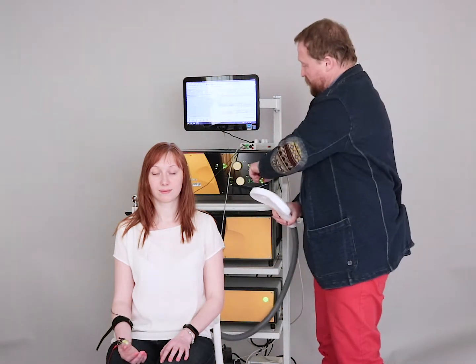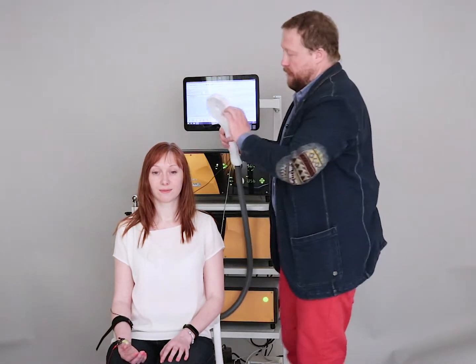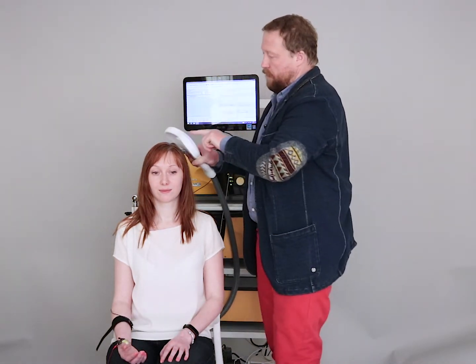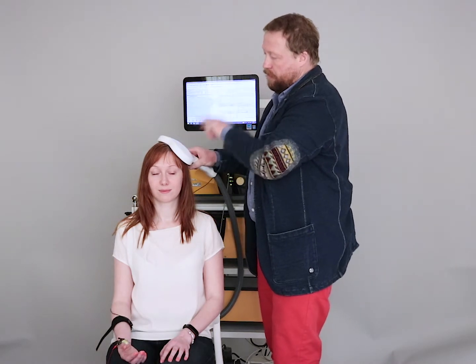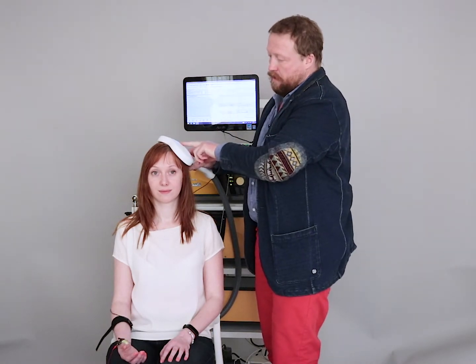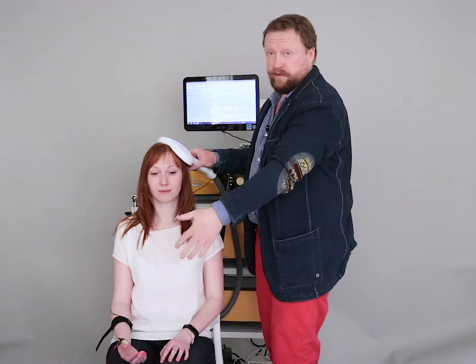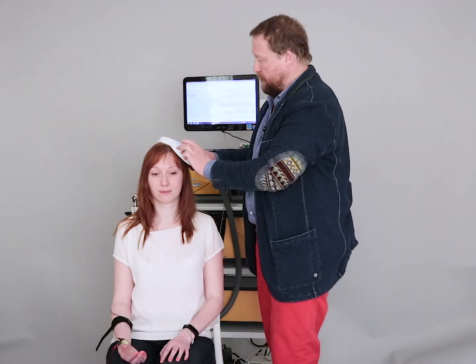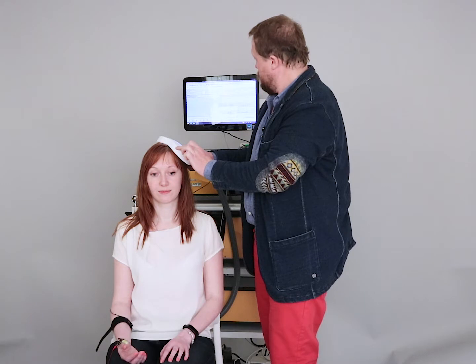I take the coil. The intensity is 50 now and I put the coil on this spot. This is the motor area of the left hemisphere responsible for the right hand movement, and I deliver the stimulus.